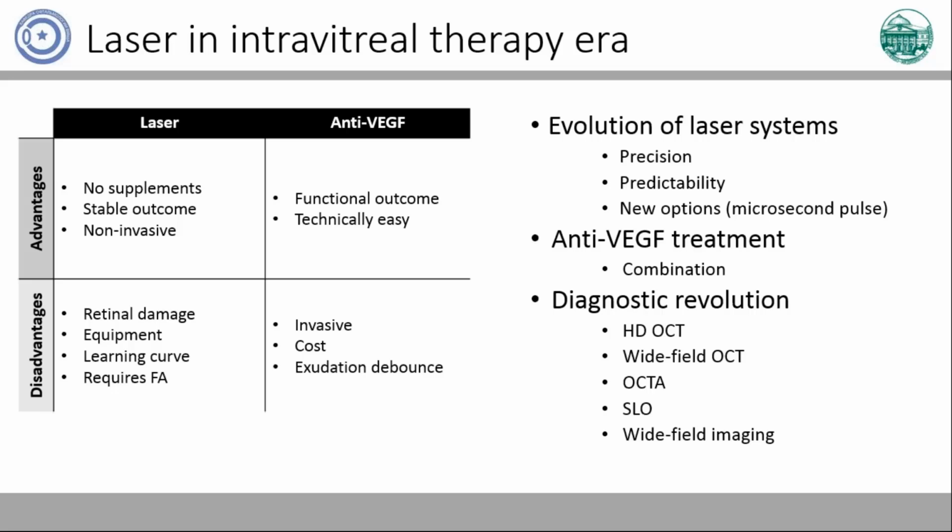First, we should remember the laser systems we operate with today are significantly different from those we had 10, 15, and of course 20 years ago. The laser systems became more precise, more predictable, and have new options like micropulse laser and specifically the navigated approach. Another thing to remember is that anti-VEGF therapy is not only an alternative, but also a very good adjunct to laser treatment, and the combination is a very good and safe option to treat many retinal disorders.